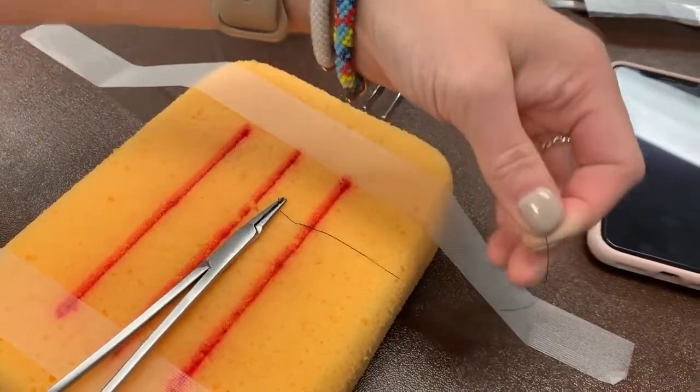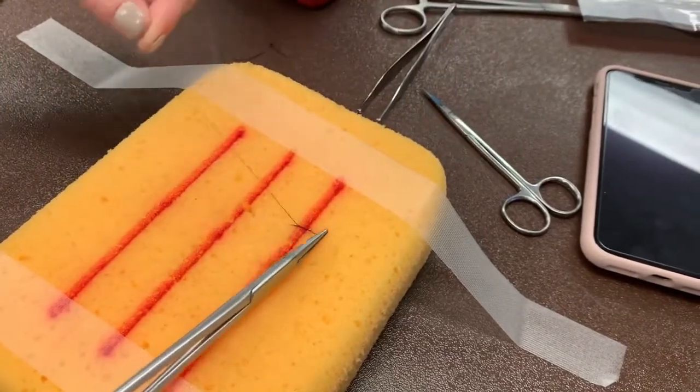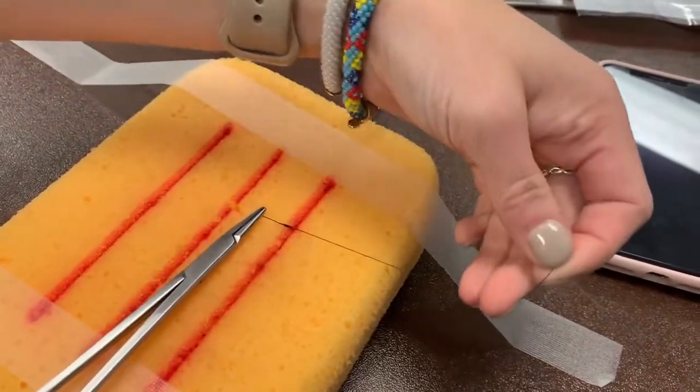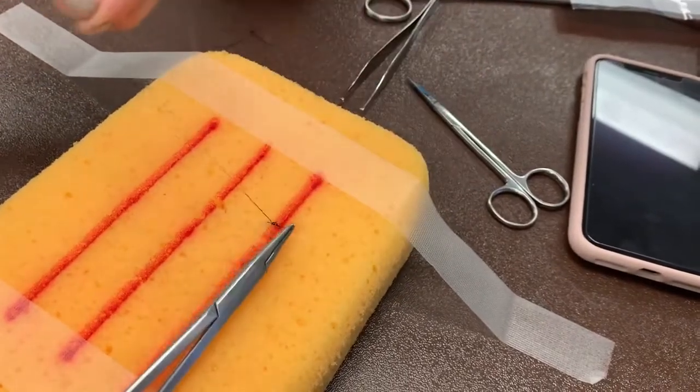Bring the driver back to the middle, loop over the driver once this time, grab the tail and pull it through. This is a square knot. Repeat the square knot two more times. Notice that the tail is grabbed at its tip and that it gets pulled to opposite sides each time.